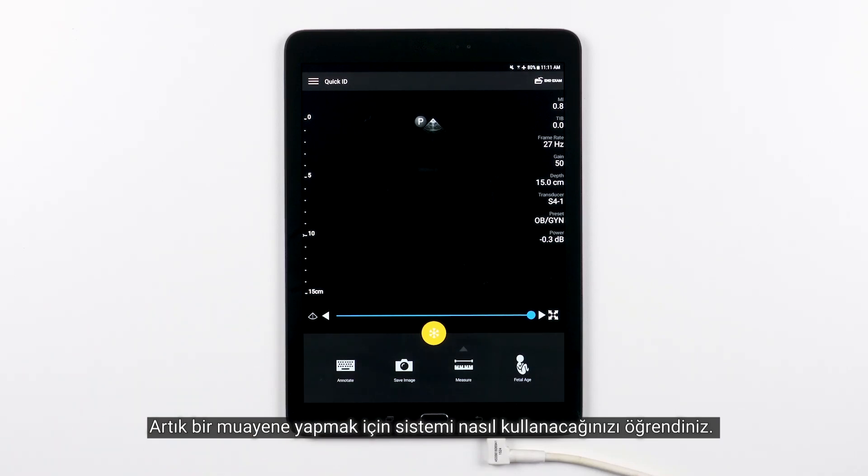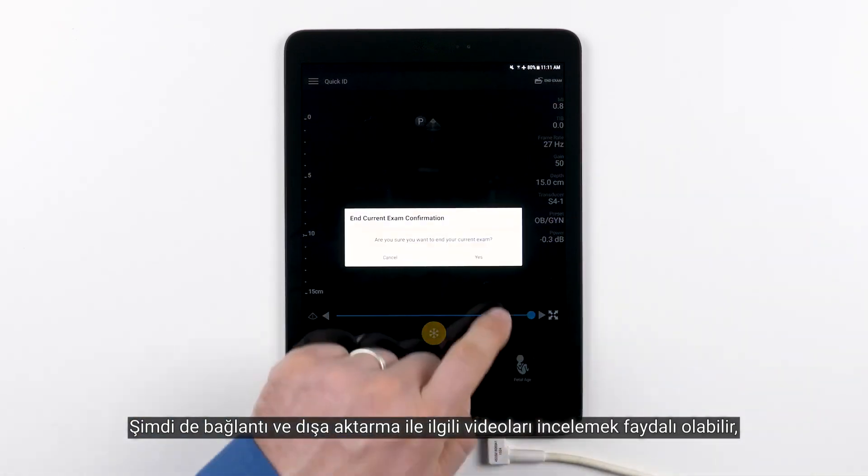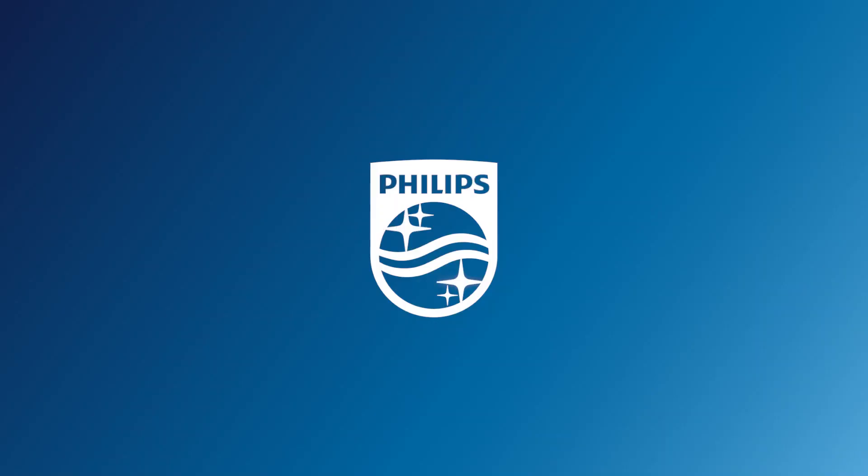Now you've learned how to use this system to perform an exam. It may be helpful to review the videos dealing with connectivity and exporting so you can ensure your exam gets safely archived to the right location.